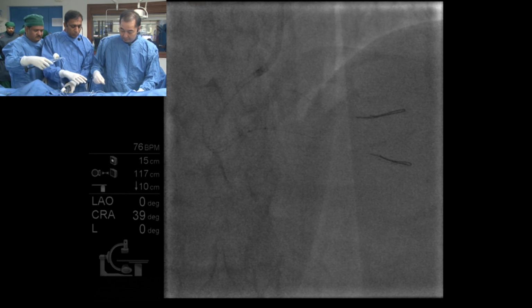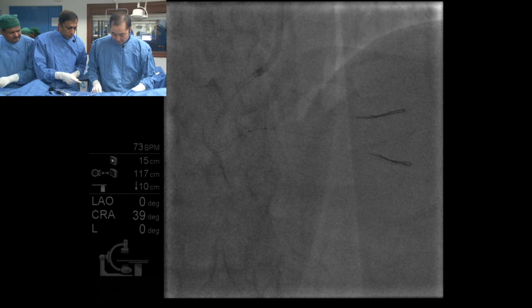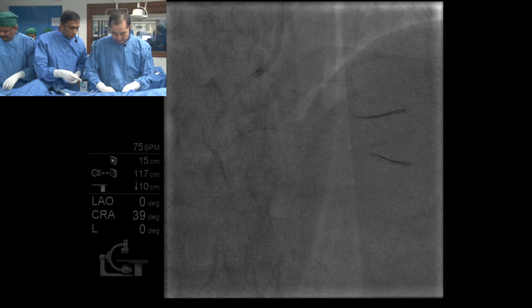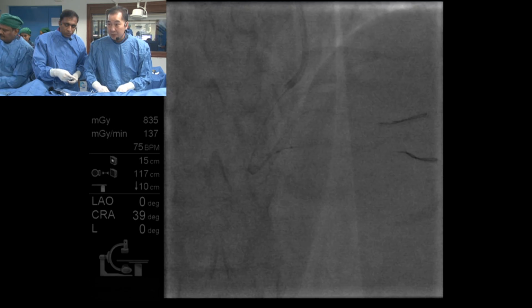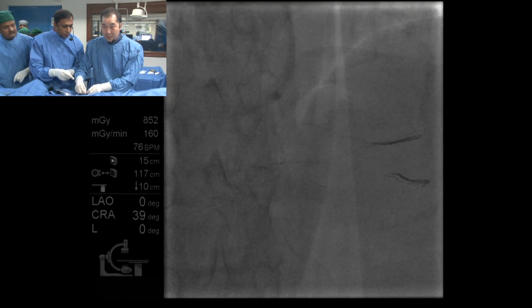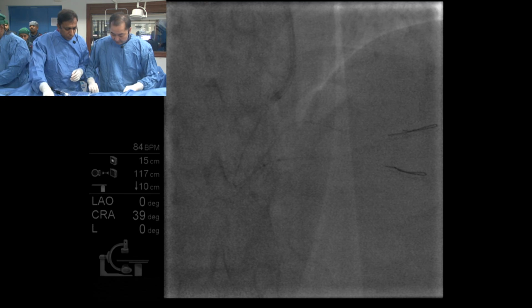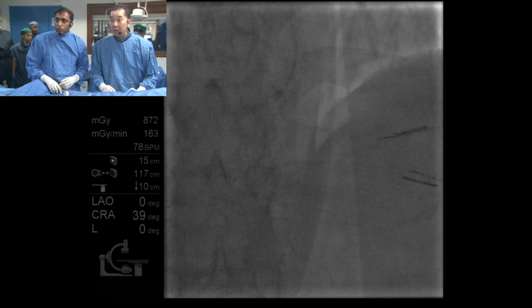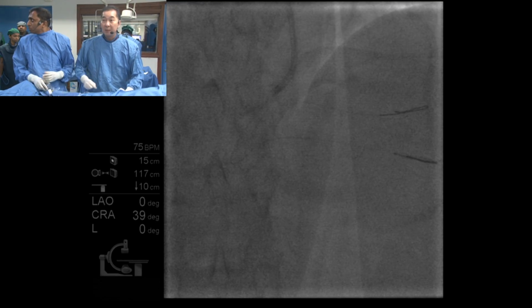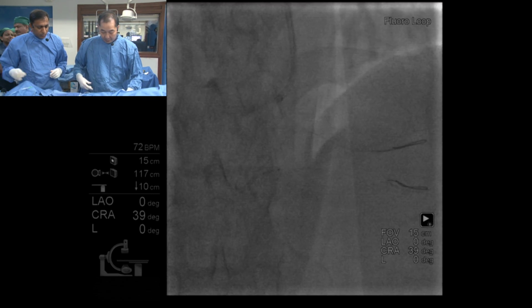So let's take the stent balloon out first. So we do it slowly one by one. In this case, I'm just using 2 different colors so I don't mess up. Sometimes I always mess up which wire. So I'm using different colors. This one's green in the main branch. I hope I remember. Now, this side branch balloon should come back without difficulty. A lot of people ask me if the balloon is not coming out. I think it should not be a problem.